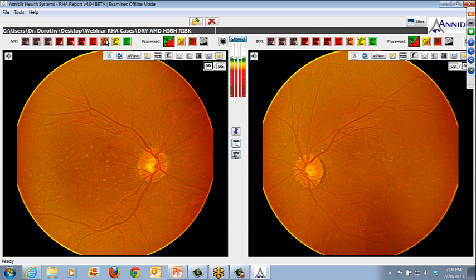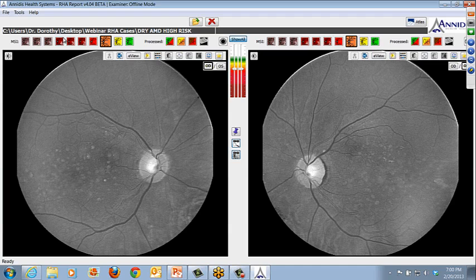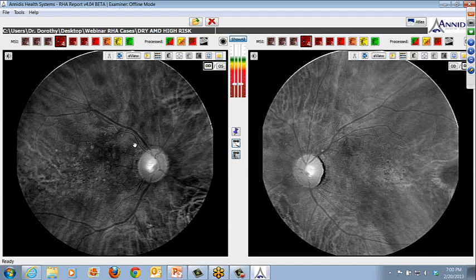So this patient has hard drusen, soft drusen, and significant RPE atrophy. This is a high-risk patient, and this is the type of patient, certainly, that should be at a minimum on the AREDS formula, and clinically I put all of them on the AREDS 2 formula based on some other studies outside of AREDS that I talked about a lot in my lecture that most of you have attended.